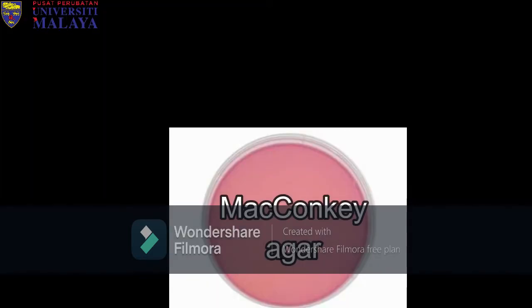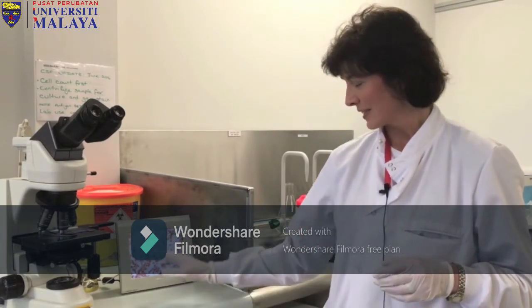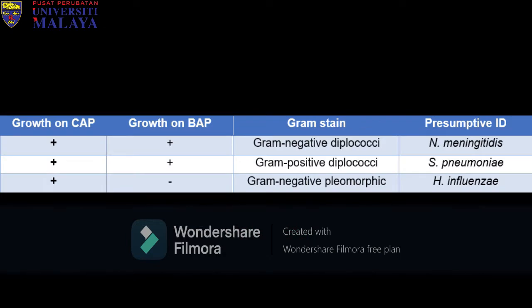After getting isolated colonies, a microscopic examination is done to get a presumptive identification on the basis of growth and colony morphology on a blood agar plate and chocolate agar plate, and also from a gram stain. Based on the results, for Neisseria meningitidis, there is growth in both chocolate and blood agar, and the gram stain shows gram-negative diplococci. While for Streptococcus pneumoniae, it shows growth in chocolate agar plate and also blood agar plate, and the gram stain shows gram-positive diplococci.